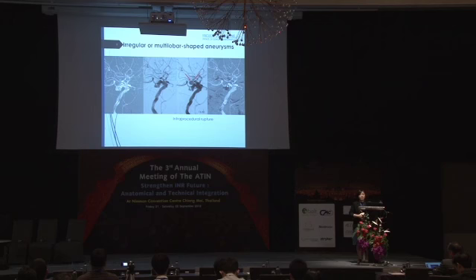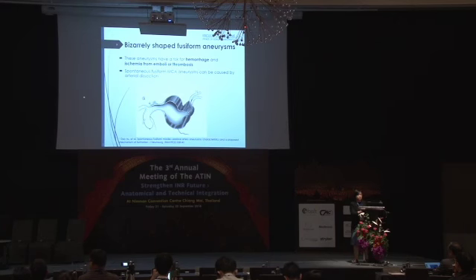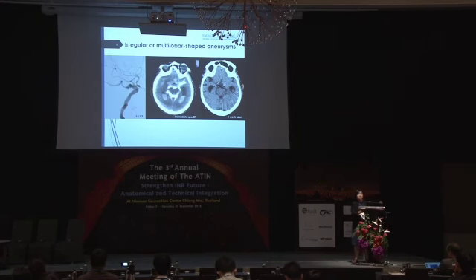In this patient, endovascular coiling was done. Intraprocedural rupture of the aneurysm occurred. Right here. Then the coil loops were quickly packed into the residual sac to stop the bleeding. The bleeding was stopped, and the aneurysm was gone. And also the right PCOM right here was still patent. However, there was an increased amount of subarachnoid hemorrhage and also increased hydrocephalus.